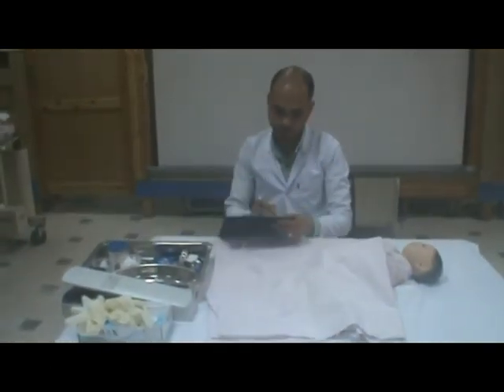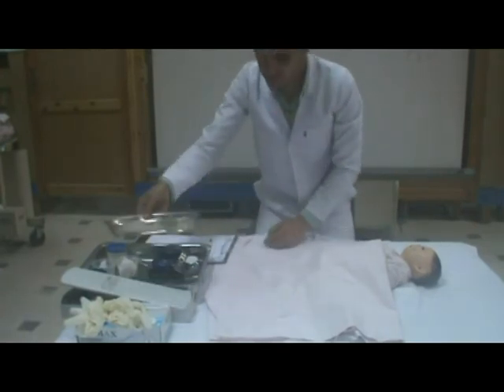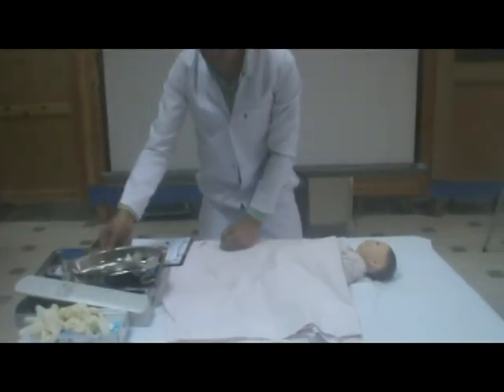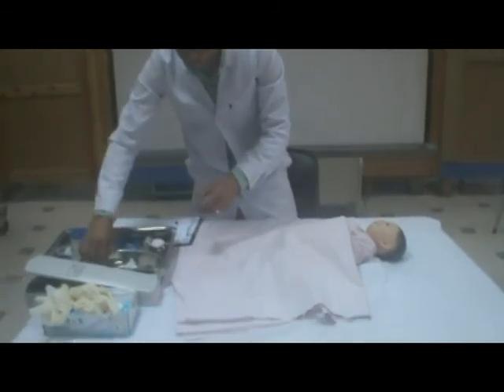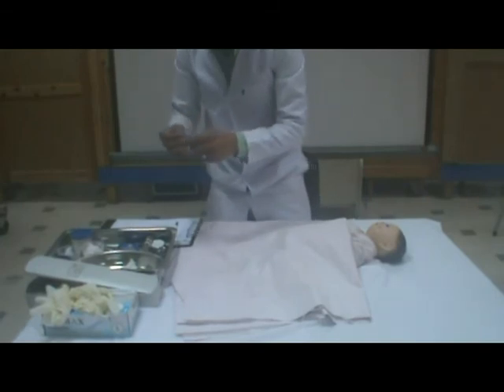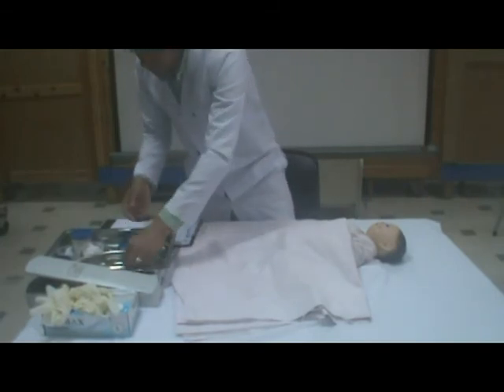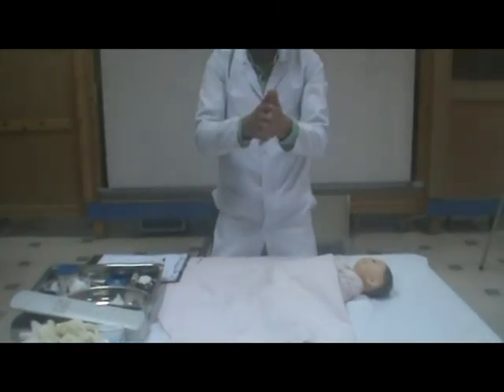Clean the thermometer with soap and tap water. Dry it and keep it in its container. Wash hands to reduce transmission of infection. Report any abnormalities.